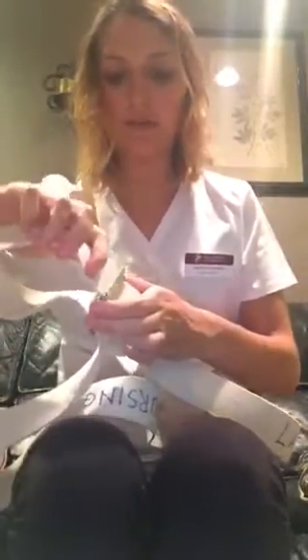When you use it, you're going to wrap it around the waist, right around here, and then when it comes back around without any kinks or twists, you're going to loop it through here, and then back around through there. You pull tight like a belt, and it's not going anywhere. You want it to be tight enough to be secure, but not causing pain to a patient. It's not going to slide up or down, and you can get your hands underneath it. So when you go to lift up, you'll reduce some of that pressure.